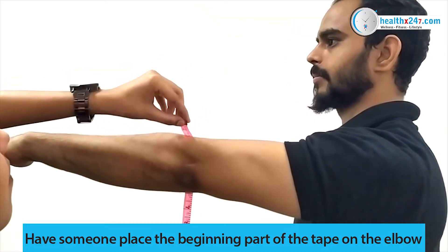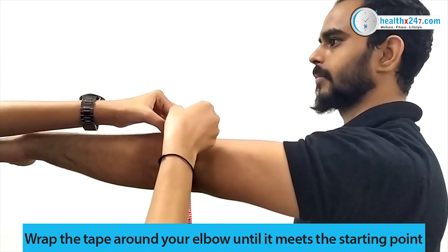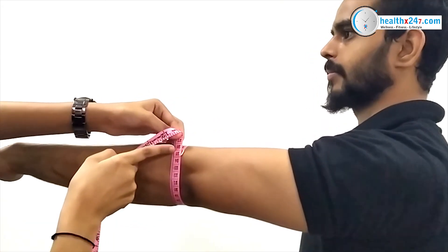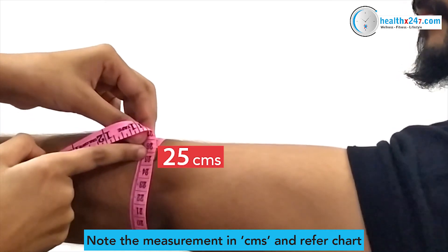place the beginning part of the measuring tape on the elbow, wrap the measuring tape around your elbow until it meets the starting point. Ensure the tape is straight and snug. Note the measurement in centimeters and refer to the sizing chart to know the best size for you.